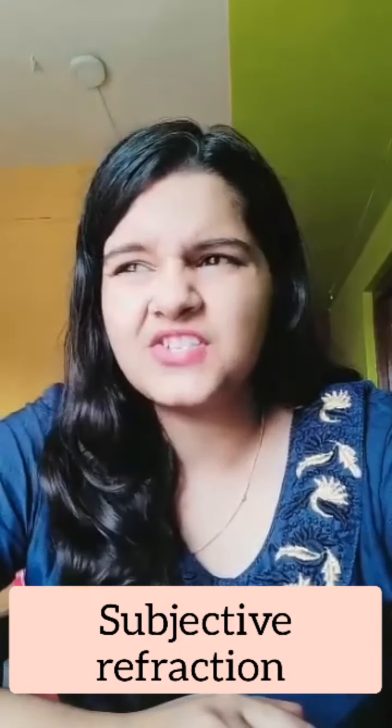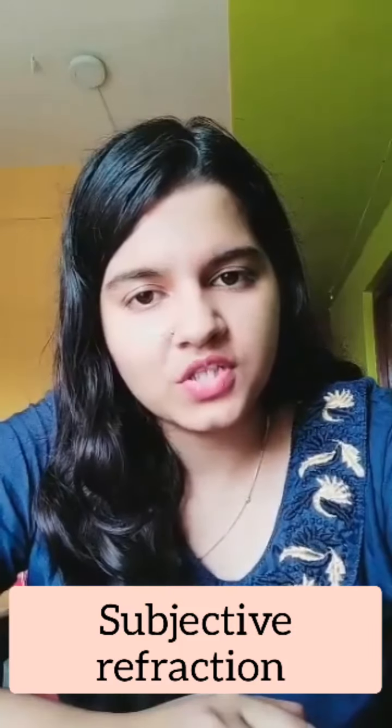So now let's talk about subjective refraction. The main advantage of doing subjective refraction is that the patient is allowed to assume their normal head position and the eccentric viewing technique. Even the examiner can see through the trial lens the nystagmus and the squint. And the main useful part is we can even use JCC, as it is very useful in determining the astigmatic correction.